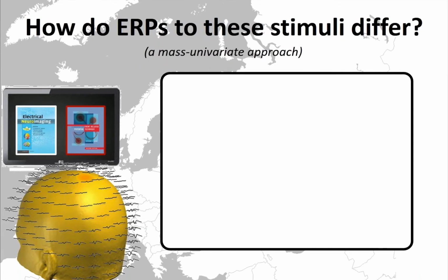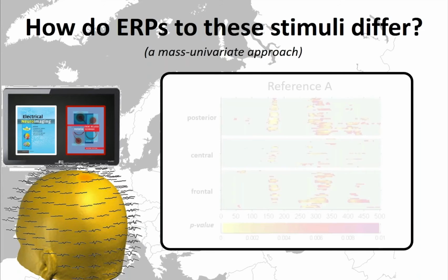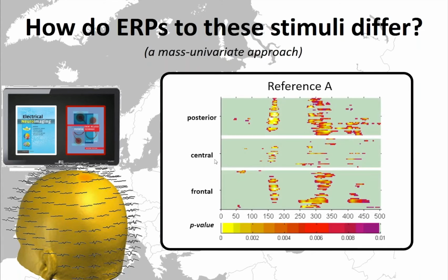And we can view these types of analyses another way. If we were to conduct a mass univariate analysis across every single electrode as a function of time, setting some threshold for what we accept as a statistically robust effect, which isn't the topic of conversation today, but we can certainly discuss it, one might imagine seeing a result, let's say a main effect of the two stimulus conditions around 150 milliseconds, and maybe another effect around 300 milliseconds, using a given reference.